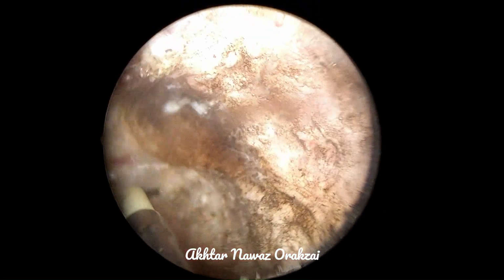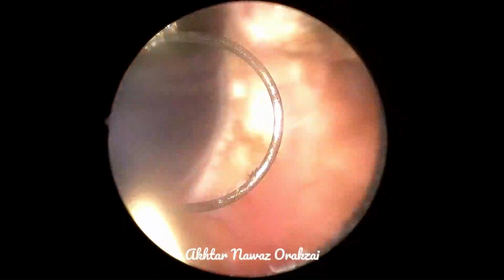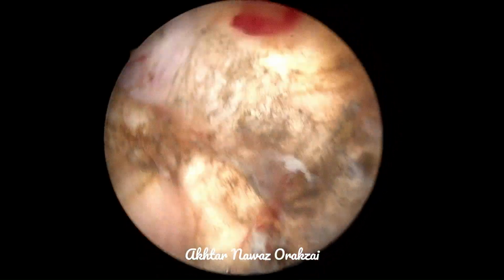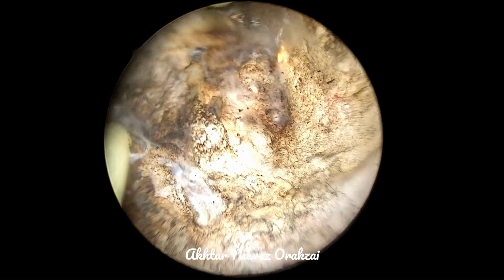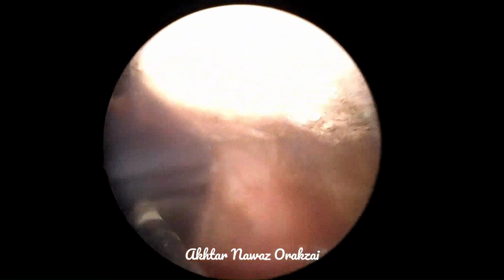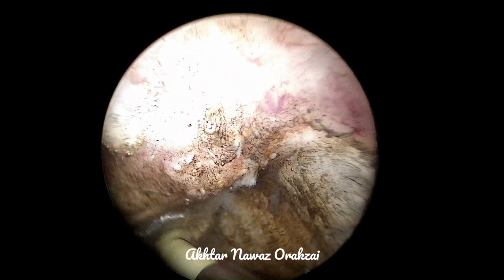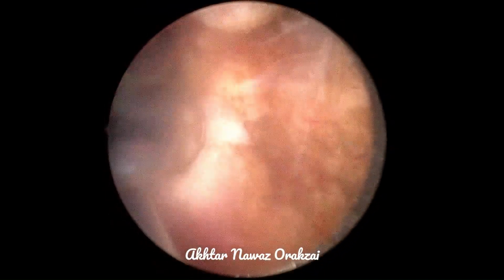So after flattening the median lobe, we usually go for the lateral lobes. I prefer to resect the left lateral lobe first. There is no scientific reason, but it becomes a personal habit. Some people like to resect the right side and some people like to resect the left side.